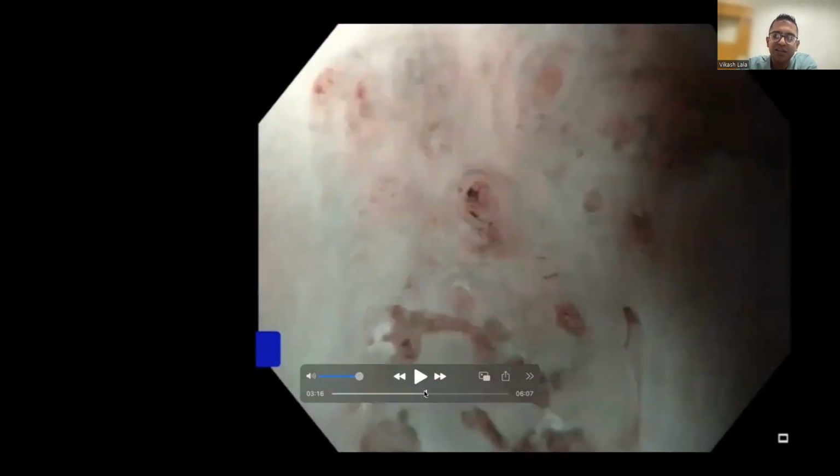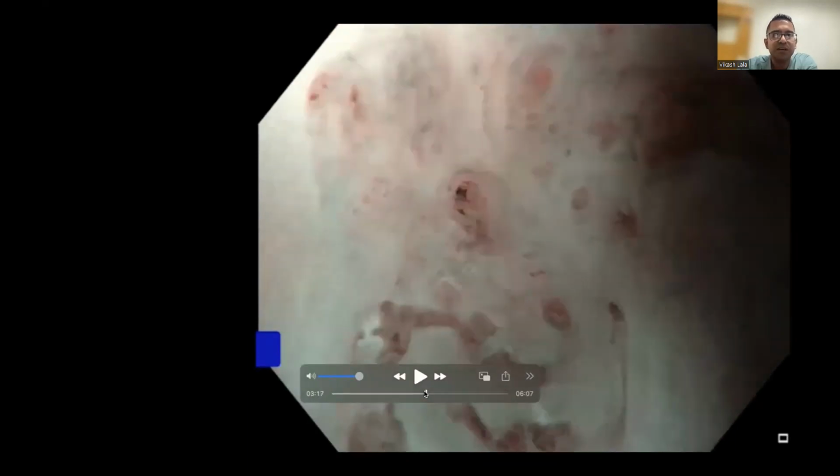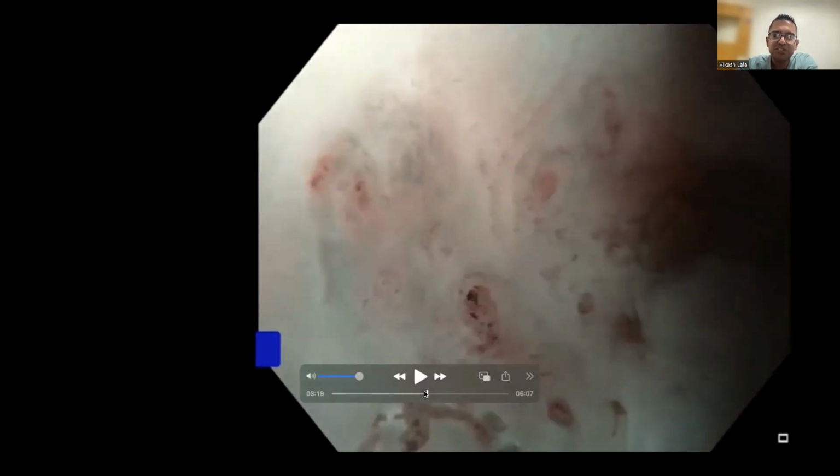And that's why you really got to get it right the first time and resect high-grade dysplasia that's visible, not just burn it, because this situation becomes very difficult to treat, especially in a 74-year-old male with a lot of comorbidities who might not tolerate an esophagectomy well and is not going to be a great candidate for surgery.